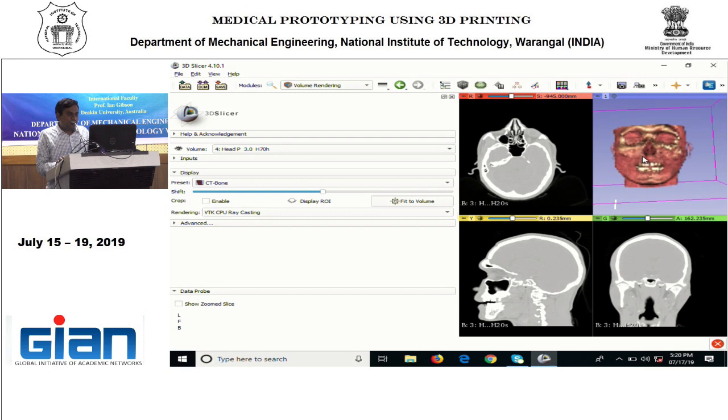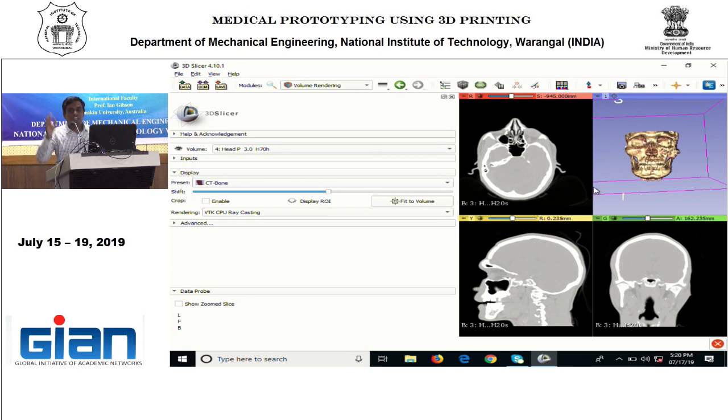Next, this is a CT bone. You can see here, this is not good. Here, this is the bone actually. This is the soft tissues. You have to eliminate the soft tissue by using the shift button. Again I am clicking here. So the total soft tissue, now you can see how it is moving. You have to play some game here. You have to adjust. In the Mimics software, actually, the threshold value you can set directly, 226 values are there.